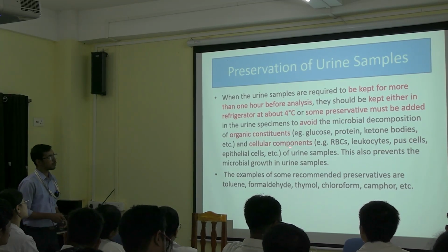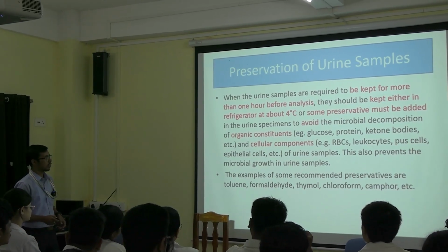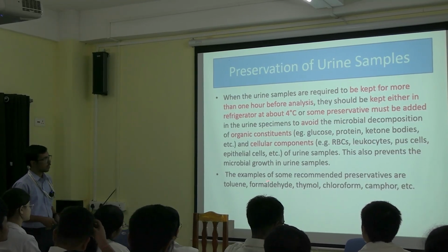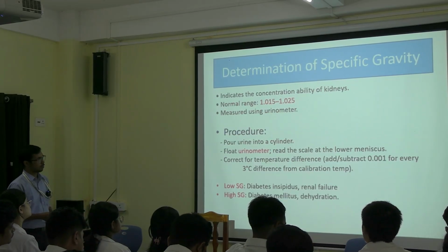So preservatives are used, which also prevent microbial growth. Some recommended preservatives are toluene, formaldehyde, thymol, chloroform, camphor, etc.